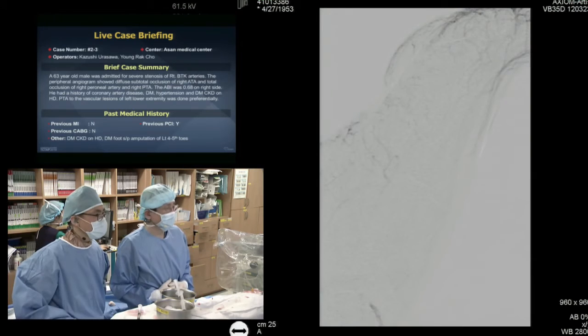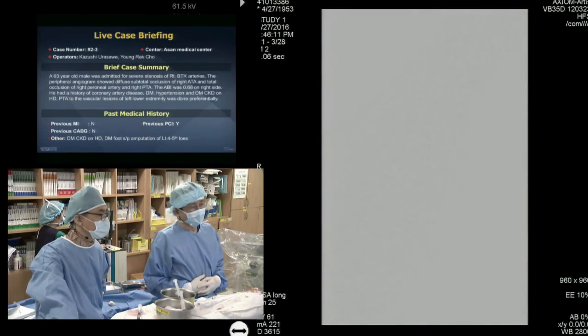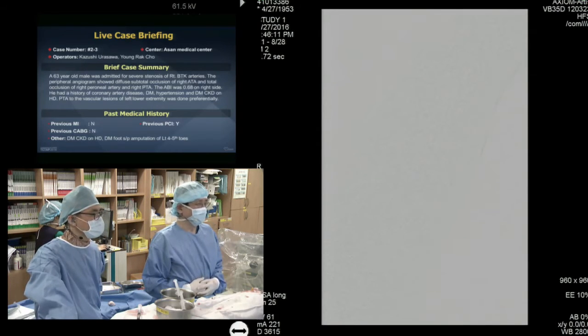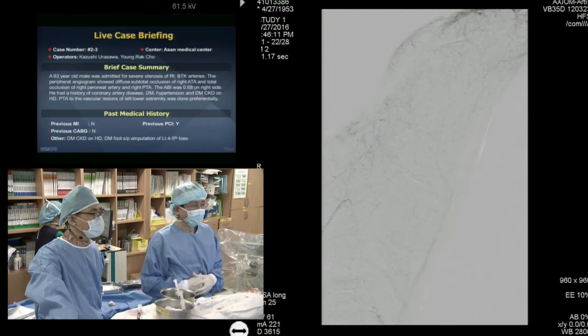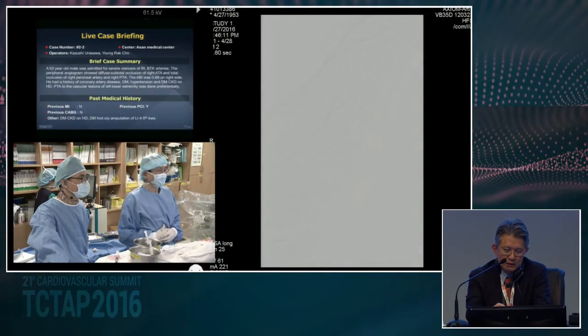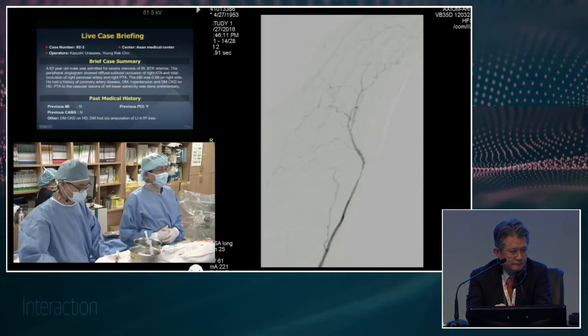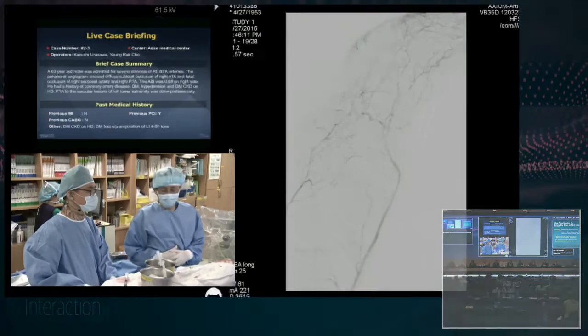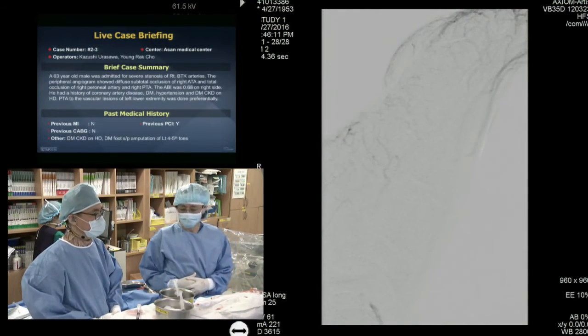So, do we have to fix that stenosis? Let's ask the panel. Maybe not. We can see calcification clearly, and we didn't expect the abrupt closure, so I think it's enough for his symptom. Yeah, I think so too. So I'd like to finish my case. Congratulations. Thank you very much. Successful procedure. Thank you. Thanks.